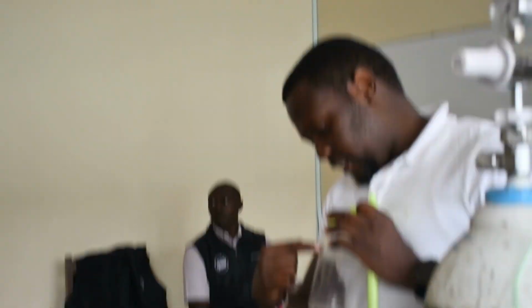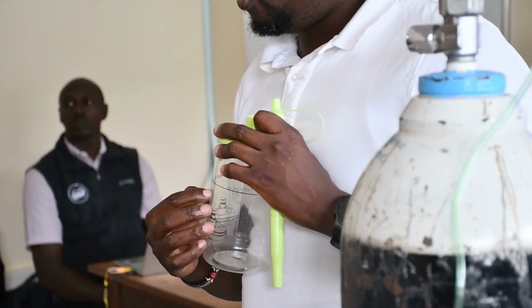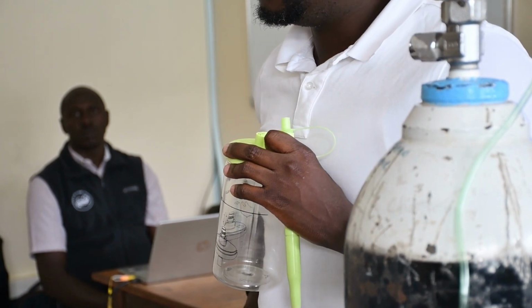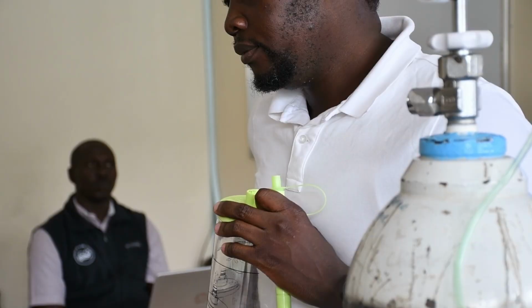If you are to let this go down, it would mean that you're providing lower pressures of water. If you are to go above this line, it will mean that you're providing higher pressures of water. Okay? So that's what you don't want to happen.